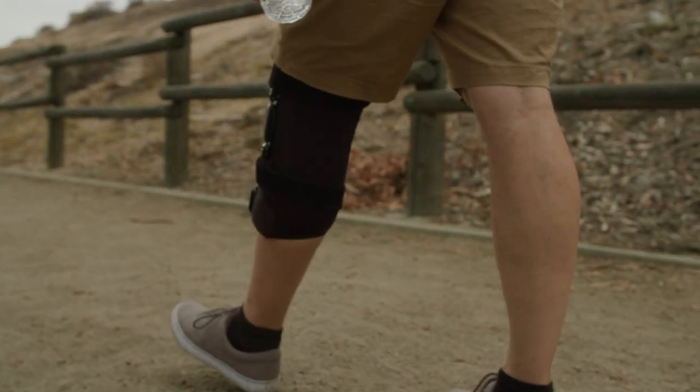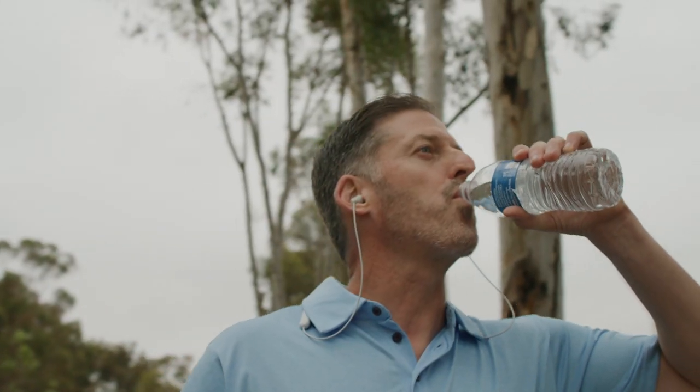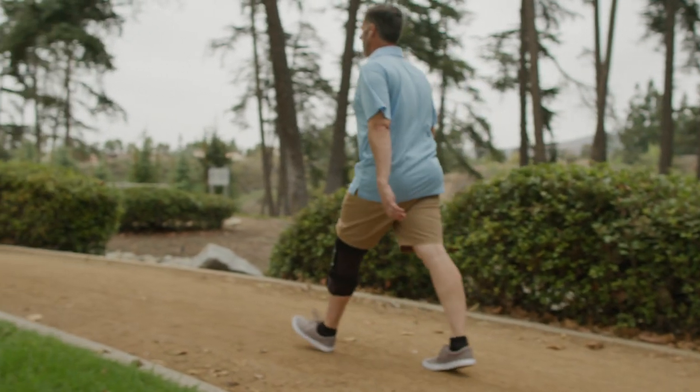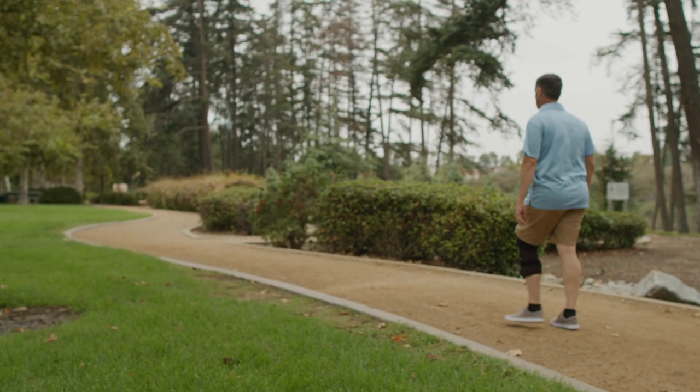Experience the benefits of a dual approach to knee osteoarthritis with the Aspen OA Knee Wrap. This video contains brace fitting instructions for clinicians to assist with sizing, in addition to information for use at home.